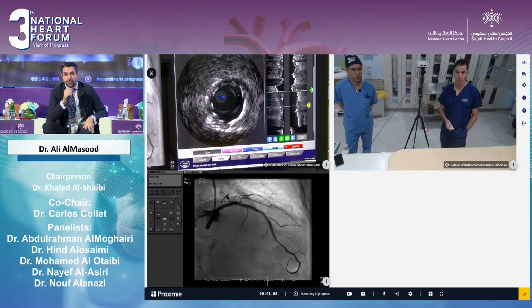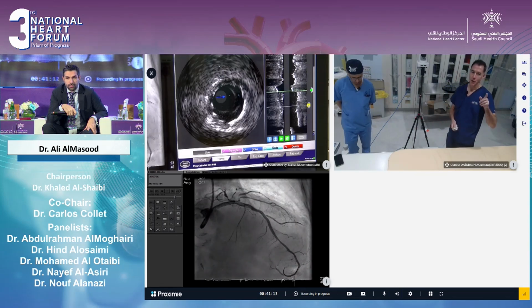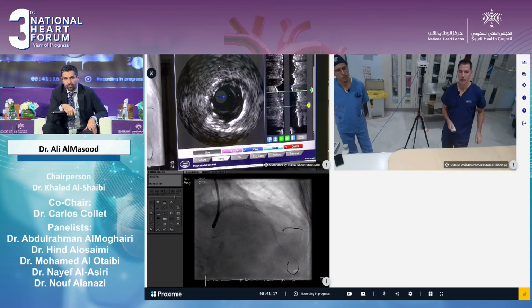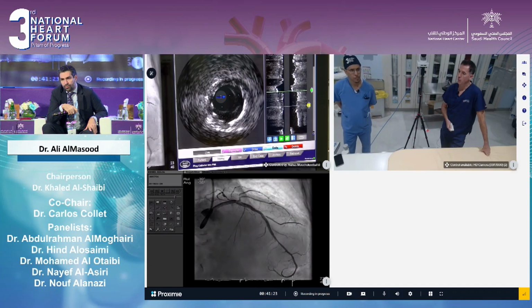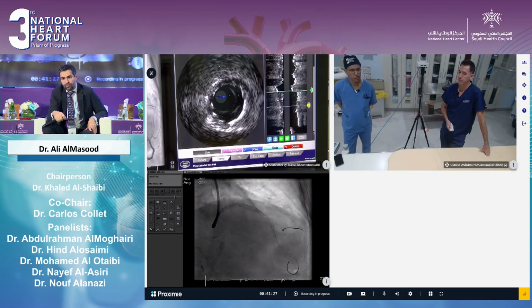Second issue, in terms of DCB: it was interesting how the patient got quite sick when the diagonal was compromised, but tolerated all the other stuff. So having kissed and opened the struts into the diagonal, we felt we were not going to put a stent into that vessel. We debated about whether DCB or not, but ultimately at the end didn't.